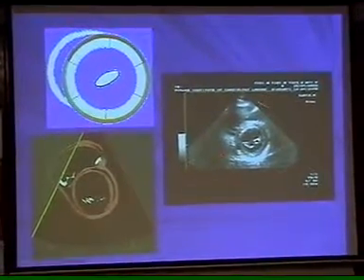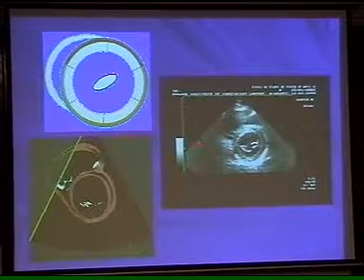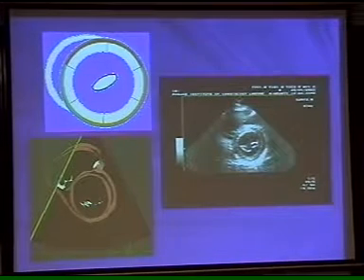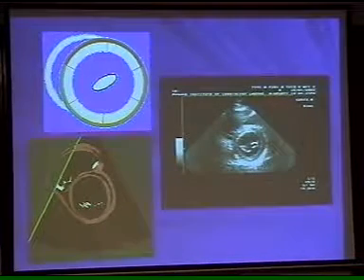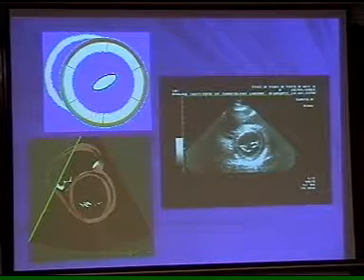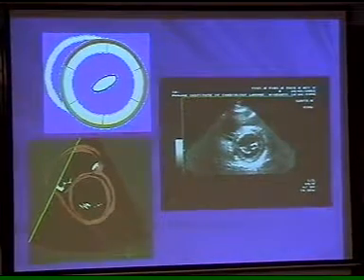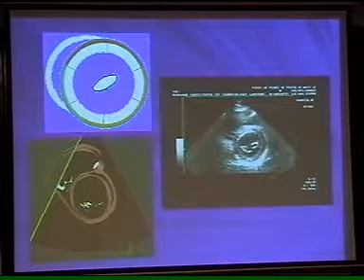Going on to short axis, at mitral valve level, you can see the mitral right in between. This is called the basal region, and it is divided into 6 basal segments: anterior septum, anterior wall, anterolateral, infralateral, inferior and inferior septum. And this is the coronary artery territory. This is LAD territory, this is circumflex territory, and this is right coronary artery. So just by doing echocardiogram, if you are good at it, going from segment to segment, you can define which coronaries are affected.